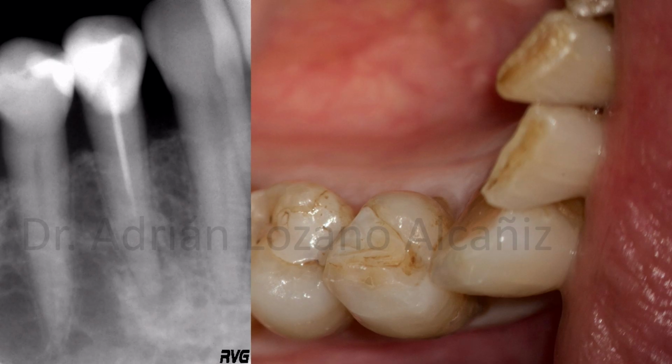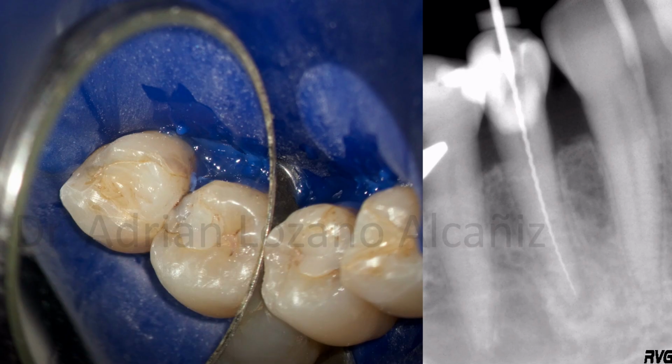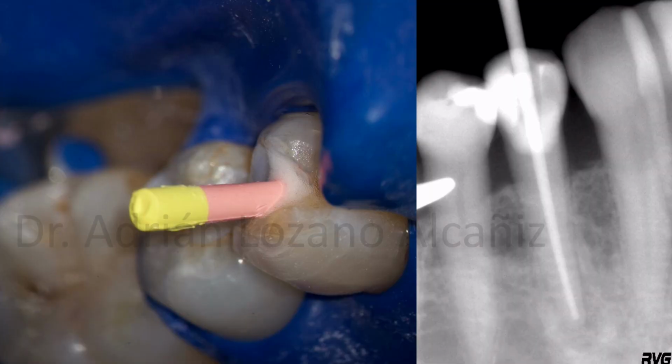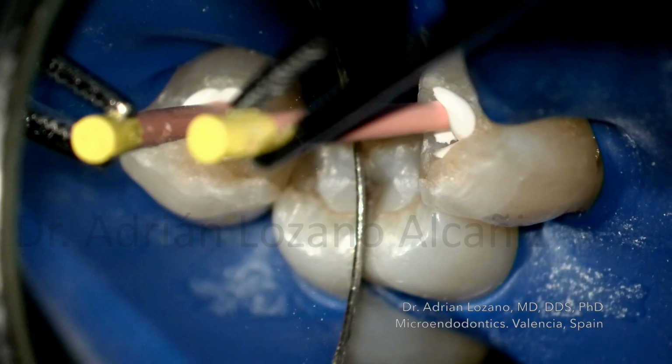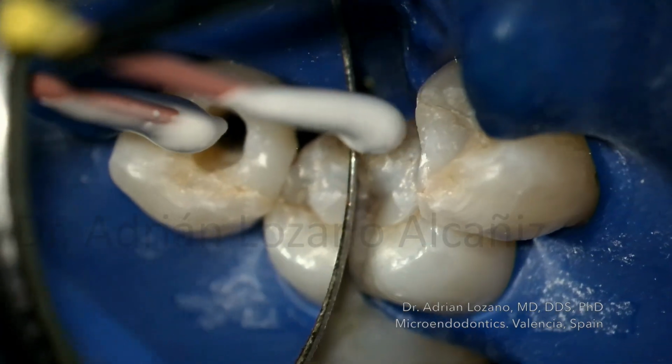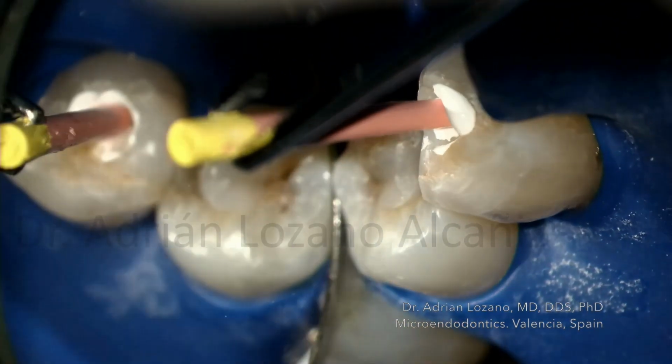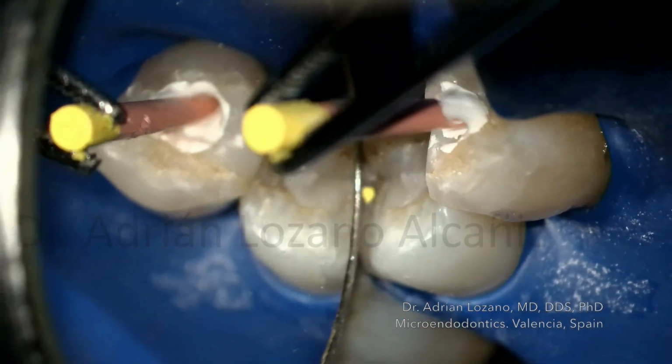This is a symptomatic apical periodontitis of tooth 44 with an apical lesion. So we retreat, we do our working length, we shape, we clean. This is the cone fit radiograph. And this is the way we put the sealer inside. You must go several times with a pumping motion.